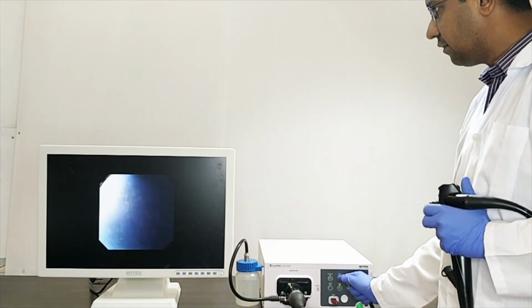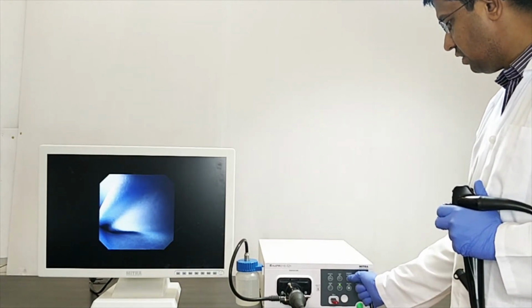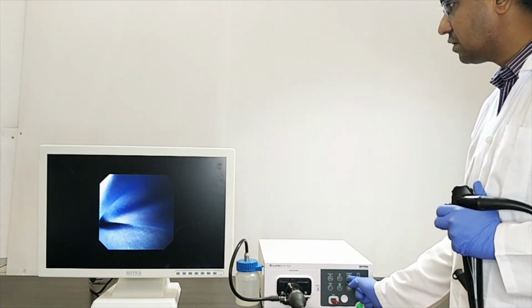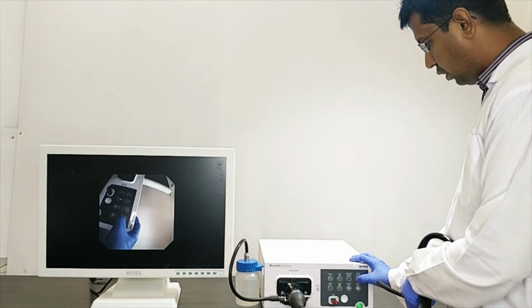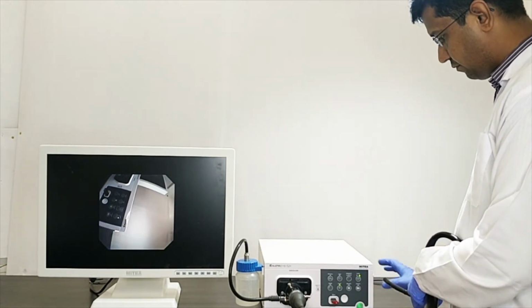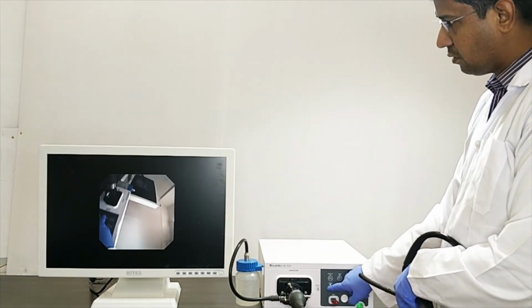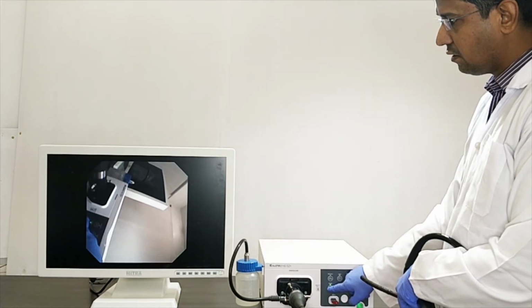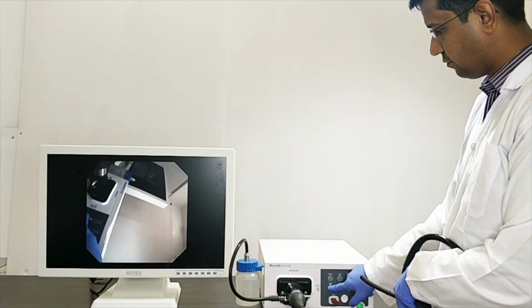You can select again. You can select whatever enhancement settings you want. Then pump low and high. You can zoom your image. You can see the image size changes, the mask size changes.